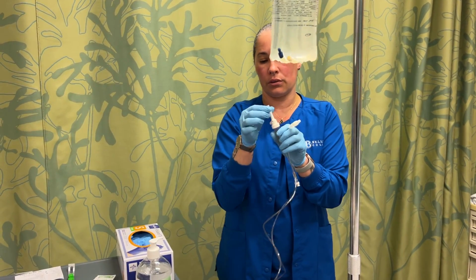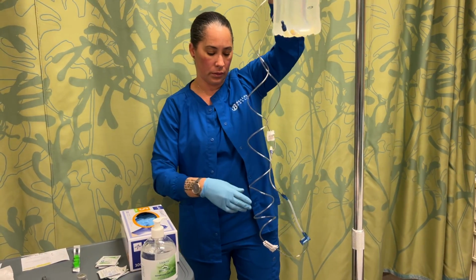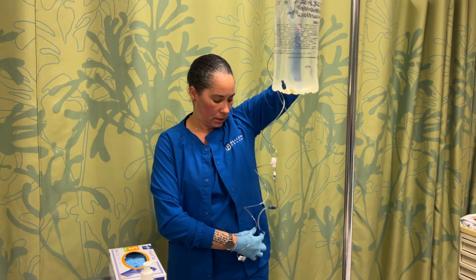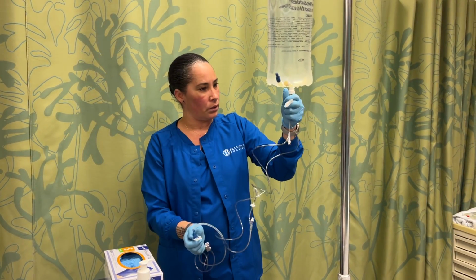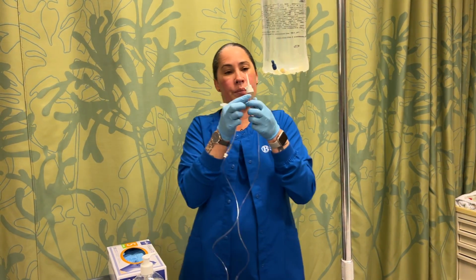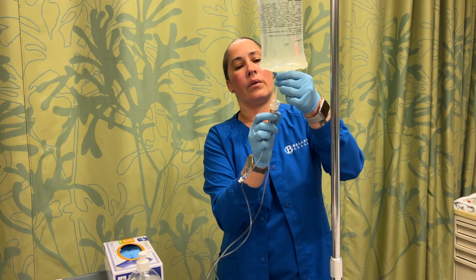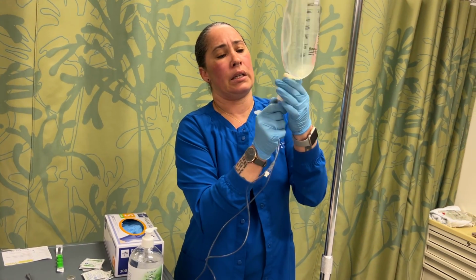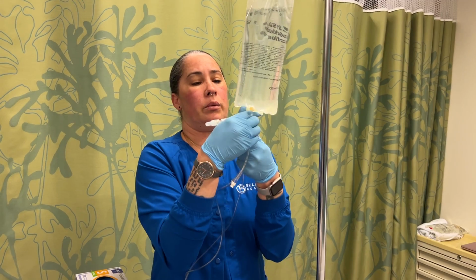So this needs to stay sterile, so you are going to clamp before you insert that, because otherwise everything's going to go all over the place. So you want to clamp any of these clamps here. Make sure that nothing is going all over the floor or all over yourself or the patient. So everything's clamped, and we're going to pull off this little cap and insert it into the bag. You're going to want to make sure that you go all the way in and straight in, because you can puncture the side of this bag, and then you will have fluids everywhere.